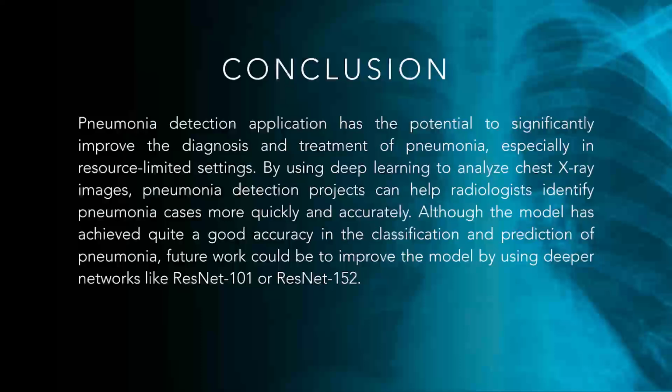These advancements are particularly beneficial in resource-limited settings, where they can lead to timely and accurate detection of pneumonia, ultimately improving patient outcomes. As we continue to refine this model and address the associated challenges, the integration of advanced deep learning techniques will play a crucial role in the future of medical diagnosis, ensuring better healthcare delivery worldwide.